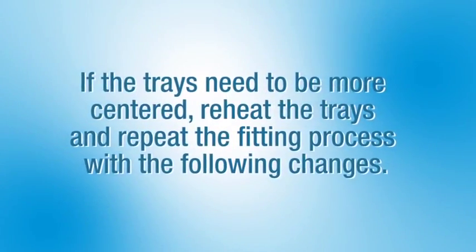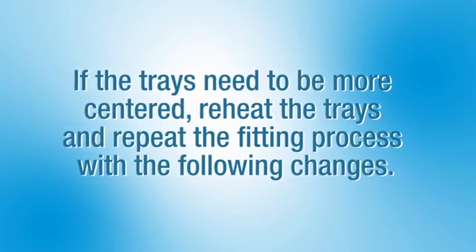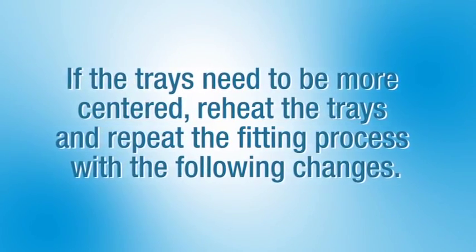If the trays need to be more centered, reheat the trays and repeat the fitting process with the following changes. Place the trays in the mouth. Look in a mirror to be sure the protruding hardware is centered under the nose.